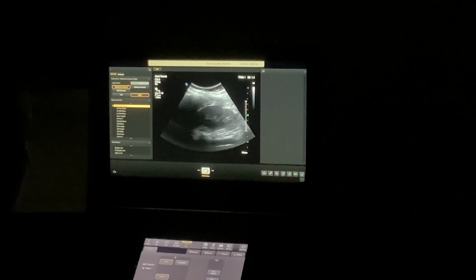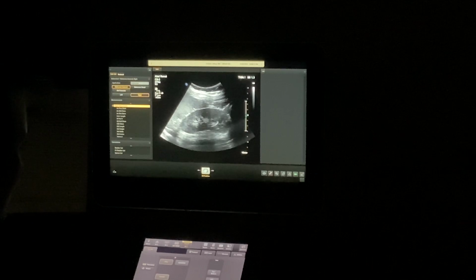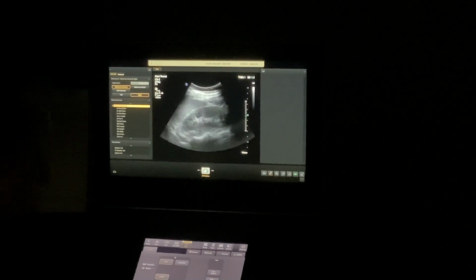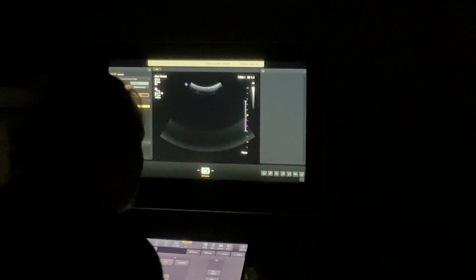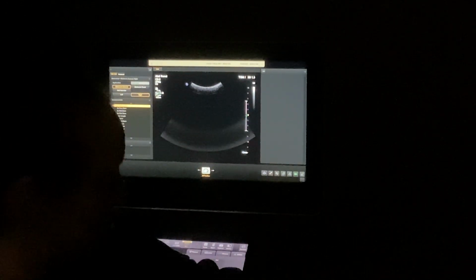Now be aware it's gonna move a little bit when you roll them. So now look at where my approach is on her. I'm like on her hip. That's my window, okay? Not all the way back here like it used to be, because now look. What even is that? That's nothing. Breathe. So be aware when you move them.